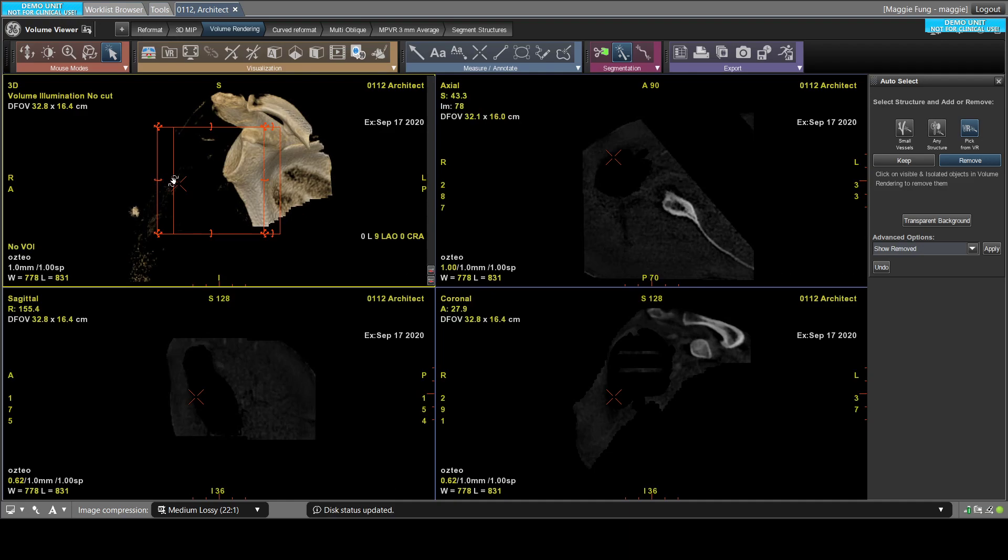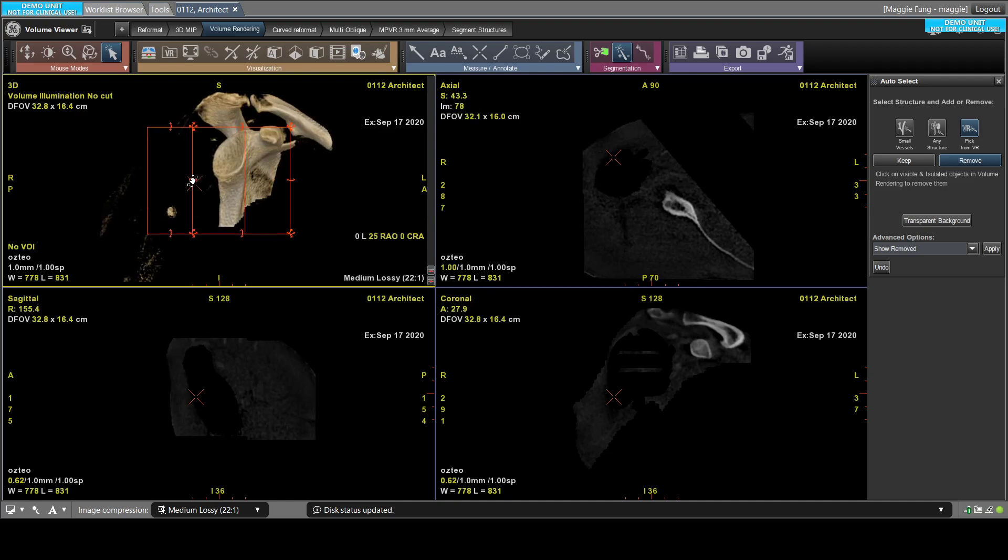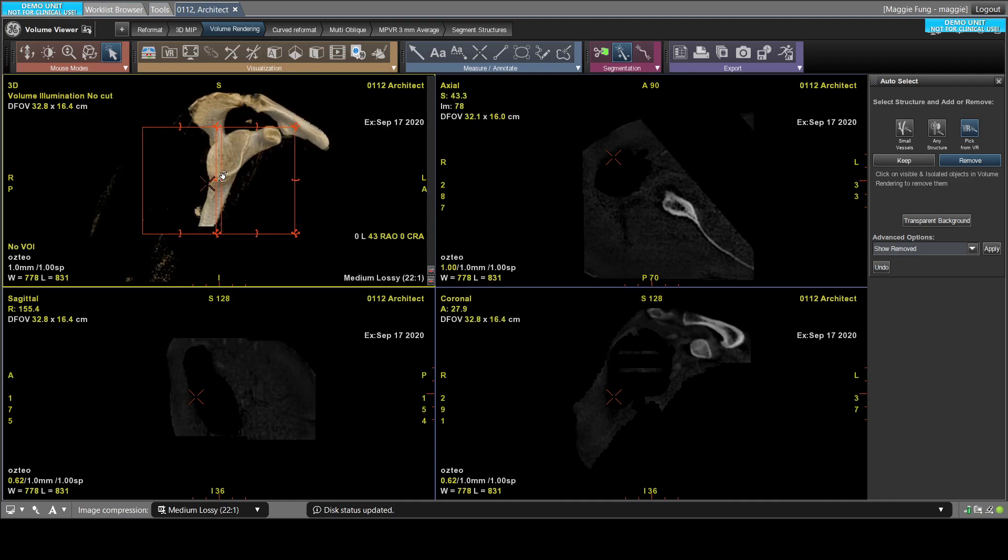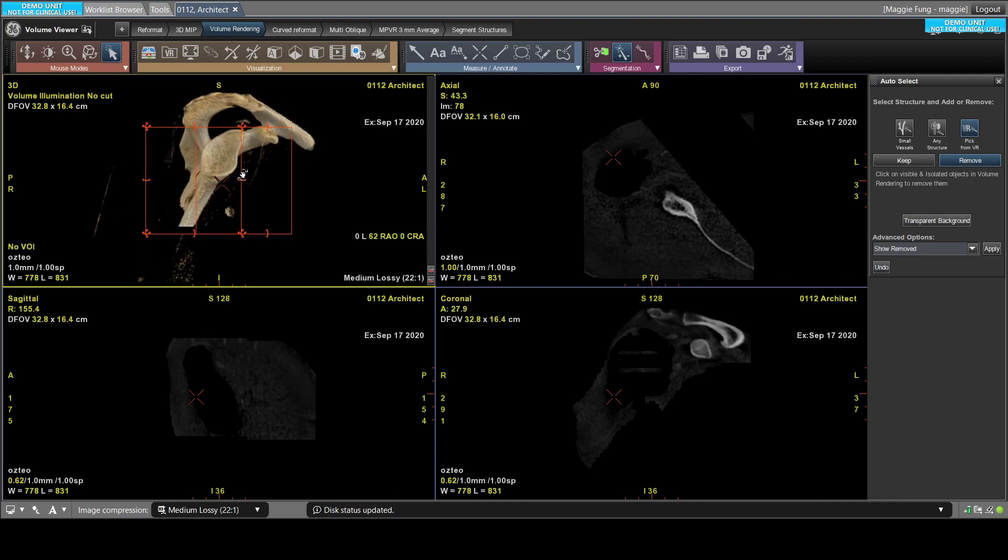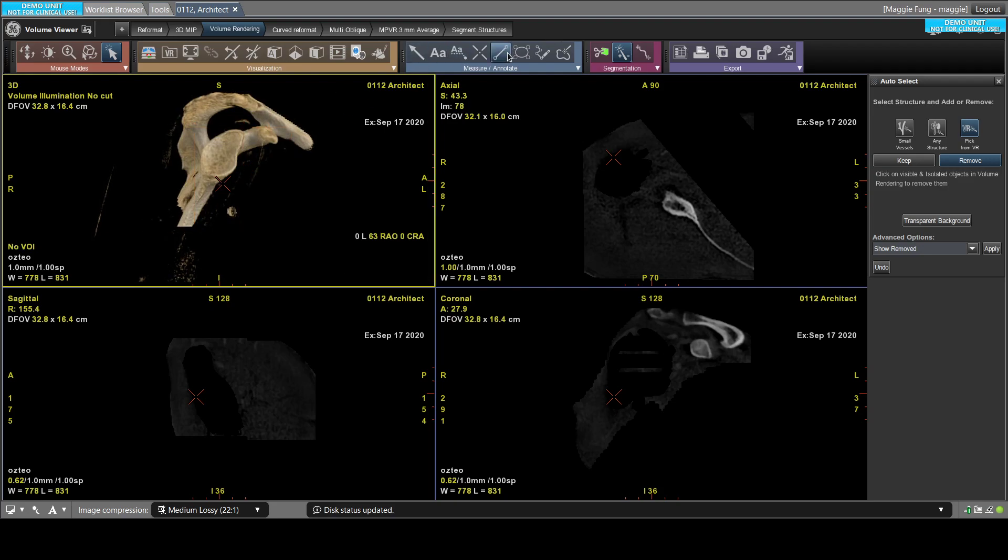You can see the glenoid surface very clearly and make measurements using the distance tool here. That's it. Thank you very much.